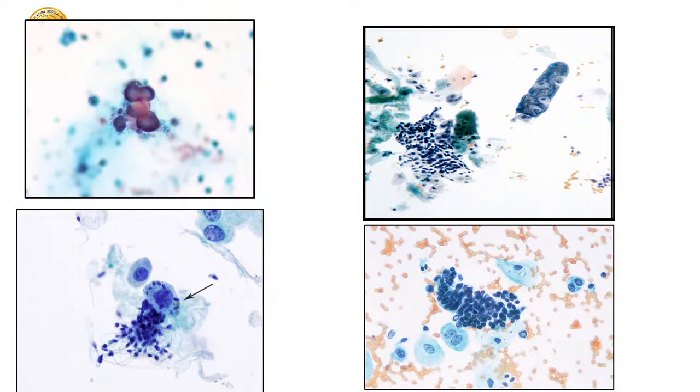Yeah, so just a few images to show you. It's pixelating for some reason. Yeah, it's okay now. So this is just to show you the urinary calculi. And if you can make out, these are borrowed from Dr. Eva's slide. So this is a specimen of a slide from a seminal vesicle. So you can see the yellowish lipofuscin pigment.